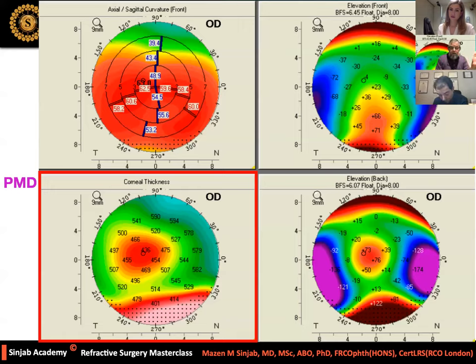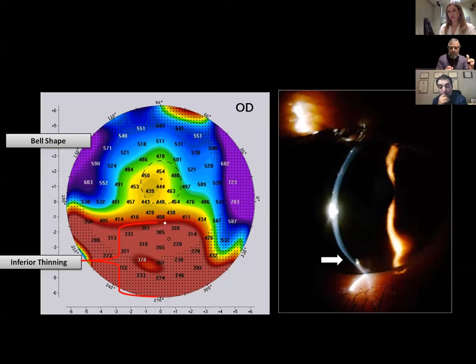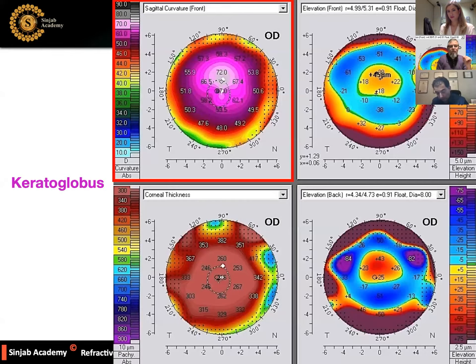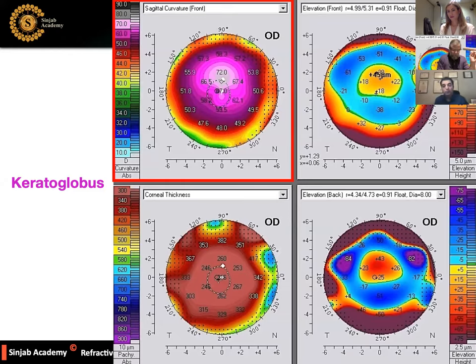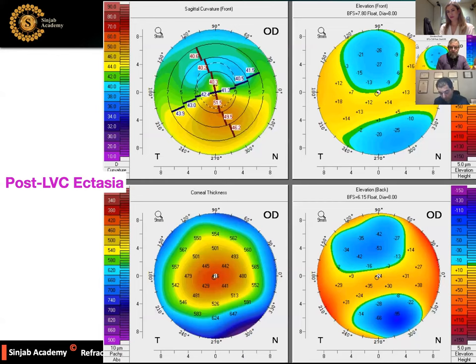Pellucid marginal degeneration: abnormal anterior curvature and abnormal posterior elevation — but the hallmark is the bell sign on the thickness map, indicating inferior corneal thinning. Keratoglobus: abnormal anterior curvature and abnormal posterior elevation with generalized thinning and generalized steepening of the cornea. Post-laser vision correction ectasia may take any shape of keratoconus or pellucid marginal degeneration, but there is a history of laser vision correction.